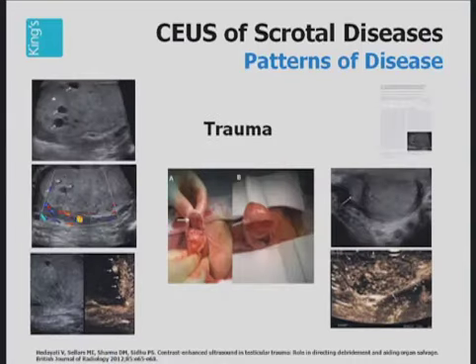Look at this patient. This patient sustained an injury when hit by a very hard ball. On the B-mode ultrasound, there are areas of hematoma present within the upper aspect of the testes, but the color Doppler ultrasound does not clearly show where the area of demarcation of viable and unviable testicular tissue is.